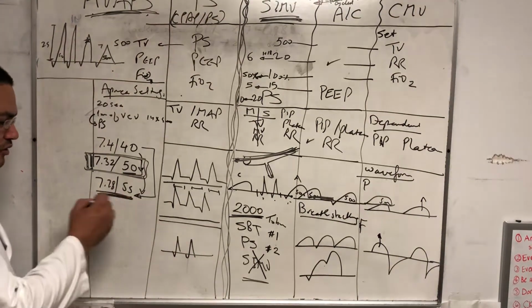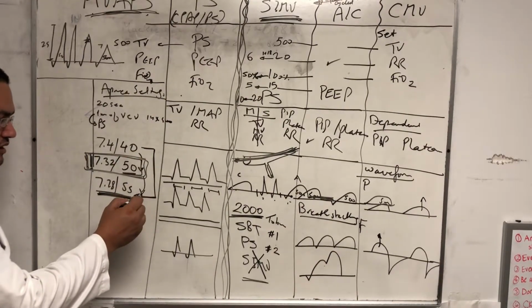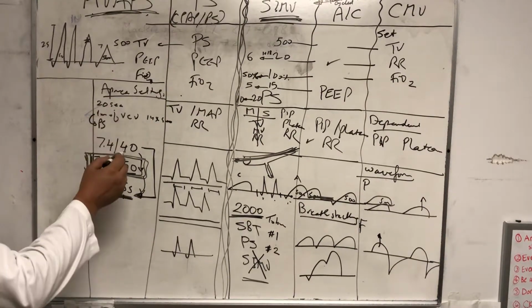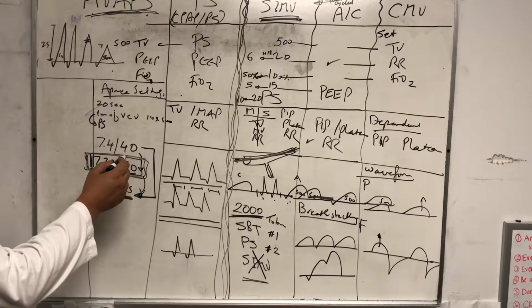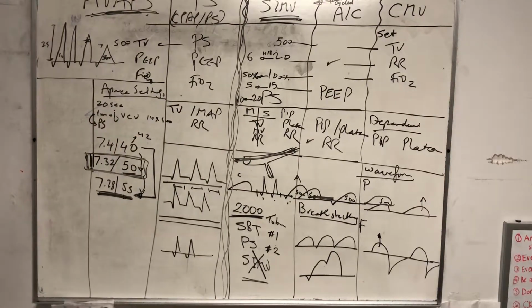So anyway, every minute I'm gonna raise it only by 6. So I need about 3 minutes or so to reach here. But in 20 seconds, the vent is gonna say, he is not breathing. I only raised this to 42 or something. This one is gonna say he's not breathing. Let's give him 1 minute of AC. We'll wash out the CO2 that he made, and then we'll put him back again at the same level that he started with. So he does it again. So it becomes a vicious circle.